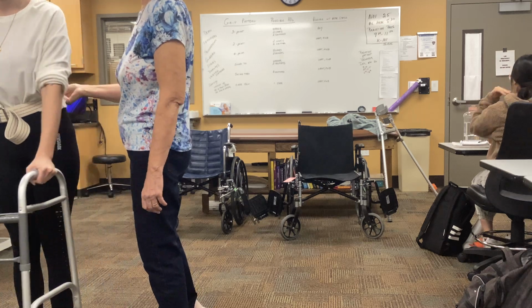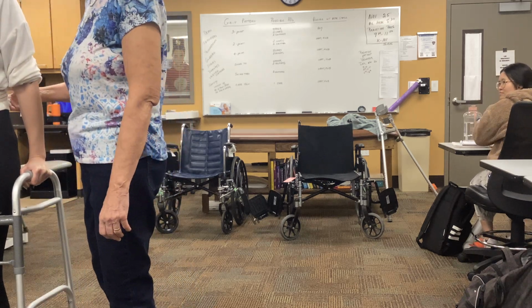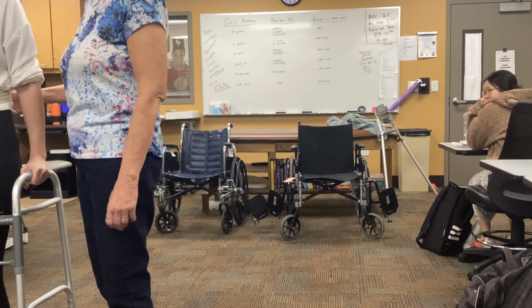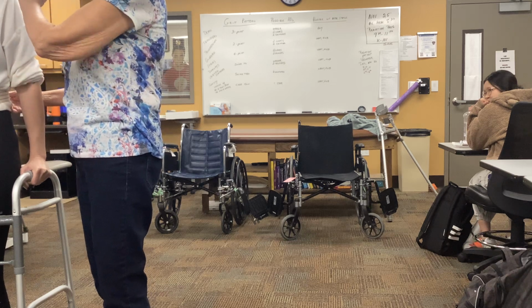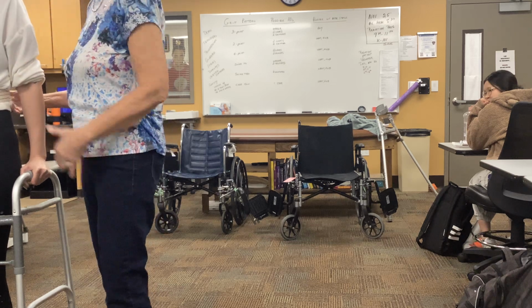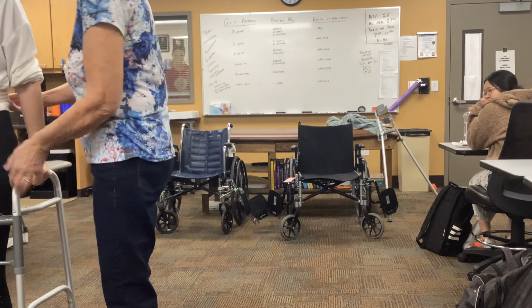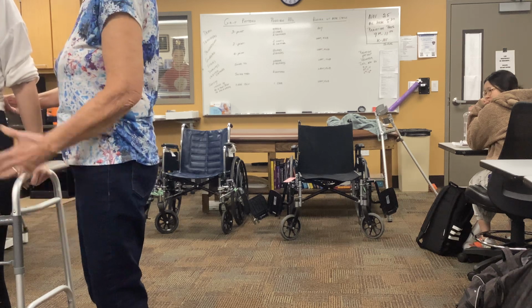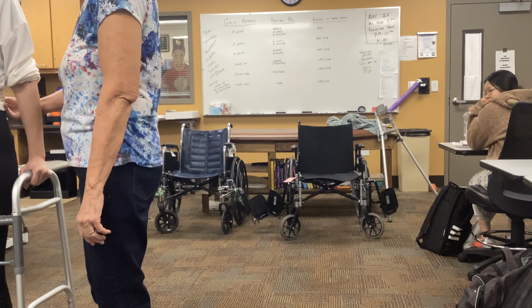What do you think? Should we be doing that? No. Why not? Because she's coming all the way to the front of the walker, which is a fall hazard. Okay, so she should be feeling tipped backwards a little bit, right? So even with our previous 3-point gait, we said you don't bring your feet ahead of the walker because it creates that backward momentum and the potential to fall.